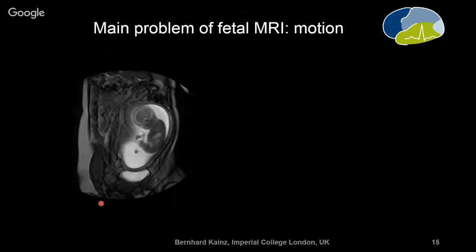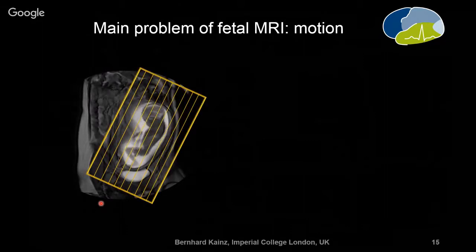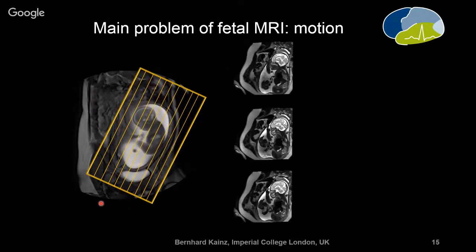What I'm going to tell you is how we actually take fetal MRI. If you put a lot of brain power into standard MRI sequence development, and this is currently also done, then you will likely come up with sequences comparable to other sequences. If you just try a naive approach and acquire a stack of slices one after each other, trying to acquire a volume of the moving fetus, then with quite some tweaks you might be successful with these individual slices. The individual slices might look quite well, with only little motion corruption. You have a kind of snapshot. These are just 3 consecutive slices of one of these stacks, and they look quite okay.